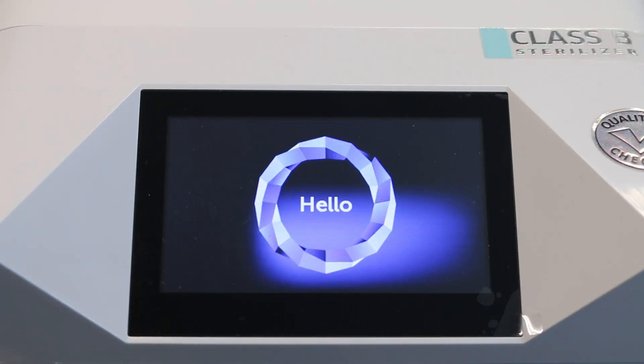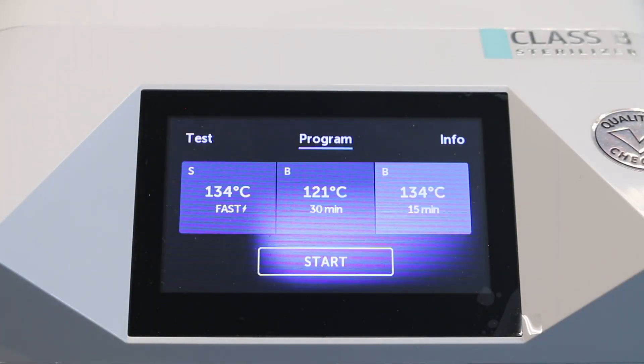You've got a simple screen which says hello. You simply tap hello — there are three options. You've got your fast cycle at 134 degrees, your slower cycle at 121 degrees, and a 15-minute cycle at 134 degrees. I will talk you through those cycles very shortly.